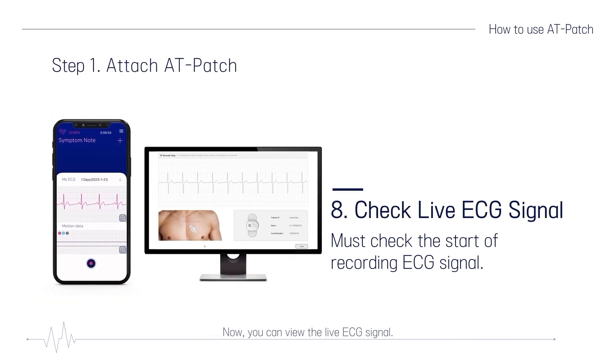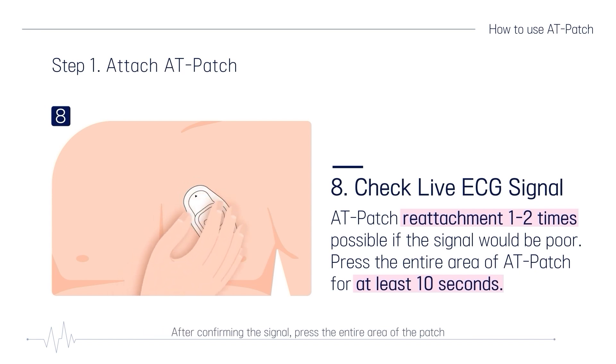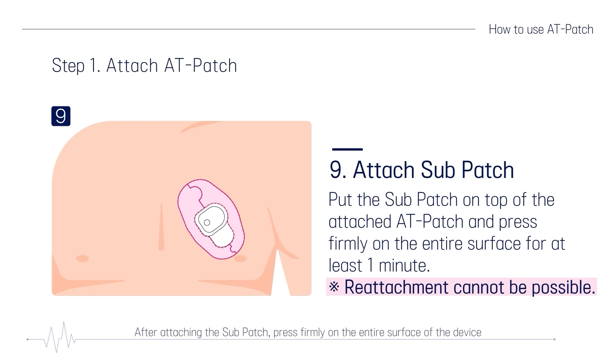Now you can view the live ECG signal. If the ECG signal is not good, adjust the attachment position of the patch. After confirming the signal, press the entire area of the patch for at least 10 seconds so that the device adheres well. Put the subpatch on top of the attached patch in the correct direction. After attaching the subpatch, press firmly on the entire surface of the device for at least one minute to improve adhesion.